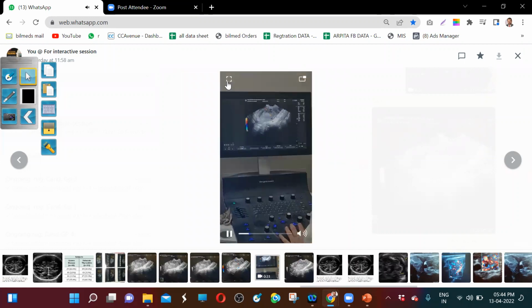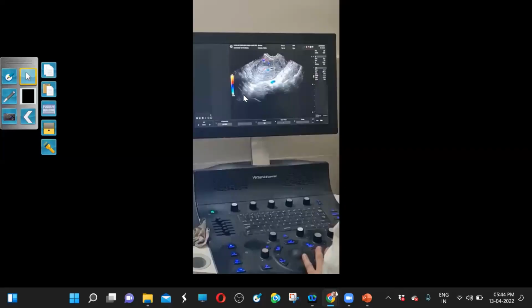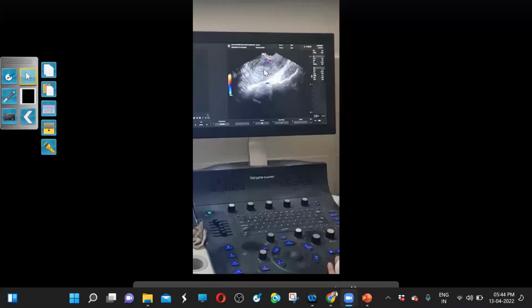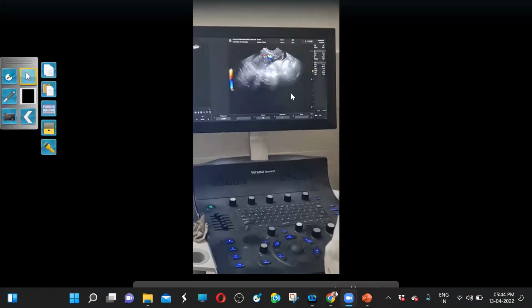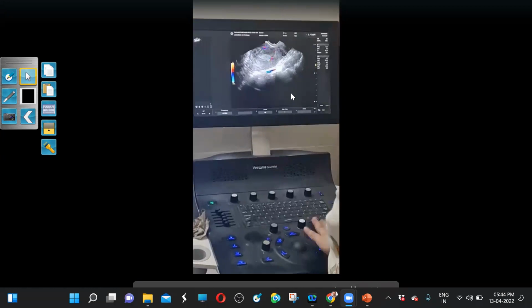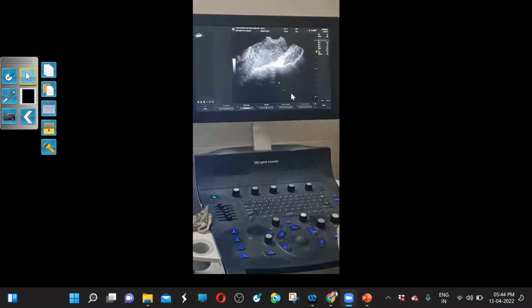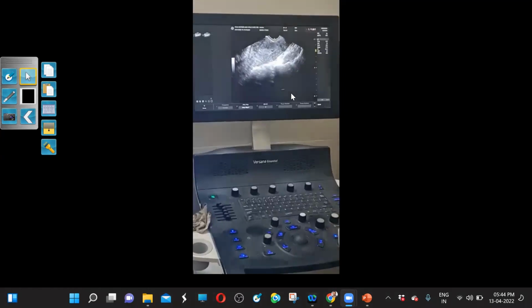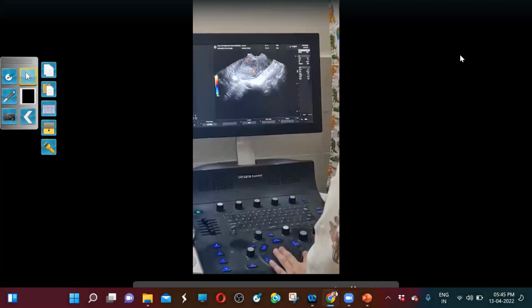Now see over here and concentrate and give the opinion what this can be. See over here. A single vessel is coming into this area, which is very hyperechoic. And this is not a luteal phase. This is day 10, day 11. But I will say, had this been day 2 or day 3, the things would have been very, very clear. But even over here at day 10, it looks like a polyp, nothing else. So now going to the detailed one, let me close all this.